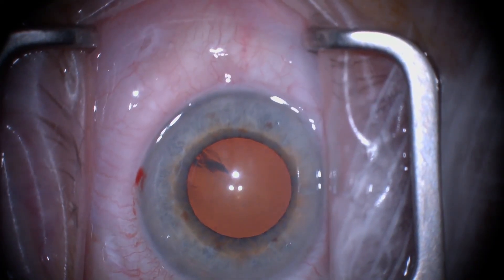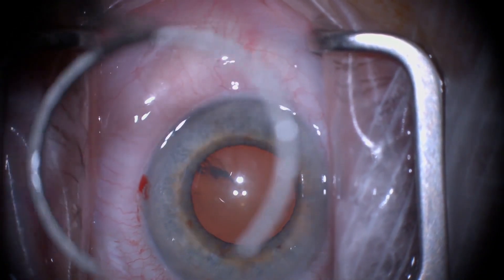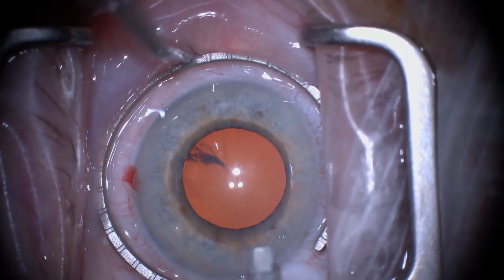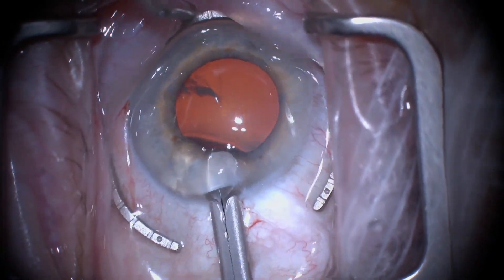I present a case of a 75-year-old patient on tamsulosin. The behavior of his other eye has already taught me the very floppy nature of his iris. Hence, I decided to place a Malyugin ring.